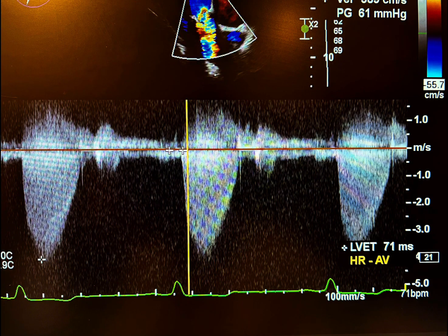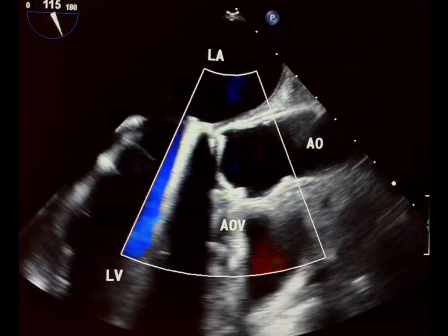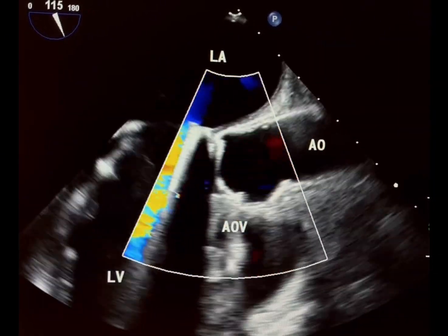The Doppler velocity index, DVI, is also extremely useful. It is the ratio of LVOT VTI to prosthetic valve VTI. If DVI is preserved, valve morphology is normal, but high gradients persist, PPM becomes much more likely than prosthetic obstruction. PPM is not limited to bioprosthetic valves. It can occur with mechanical valves and transcatheter heart valves.